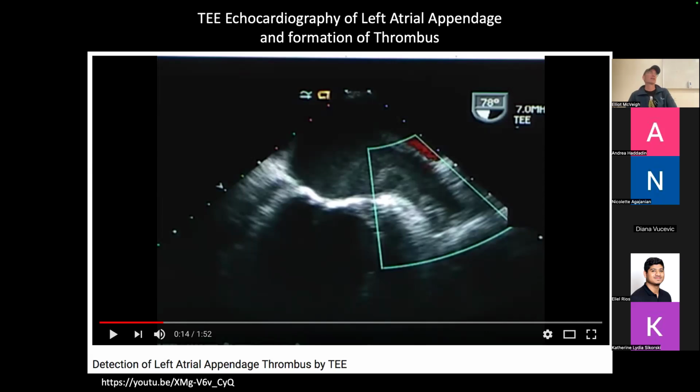And that takes about a week. And they bring that patient back and look and see if the clot has been dissolved. Well, in this case, the clot will have been dissolved because it was never there, right? Because it was a false positive. So you put the patient on a drug for a week.